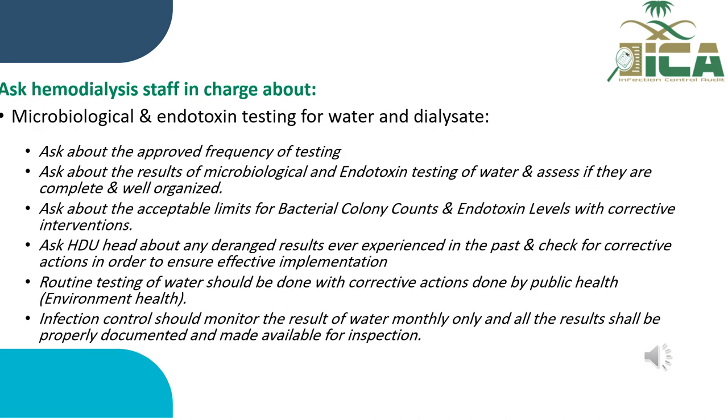Ask hemodialysis staff in charge about microbiological and endotoxin testing for water and dialysate. For example, ask about the approved frequency of testing and ask about the results of microbiological and endotoxin testing of water and assess if they are complete and well organized. Also ask about the acceptable limits for bacterial colony count and endotoxin levels with corrective interventions.